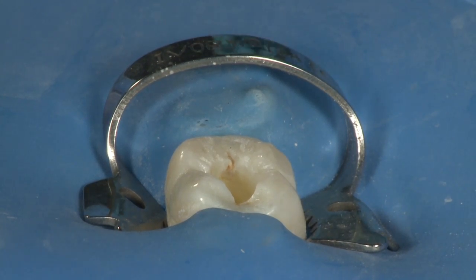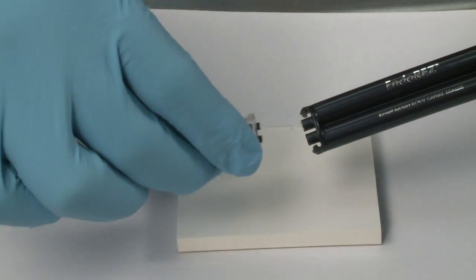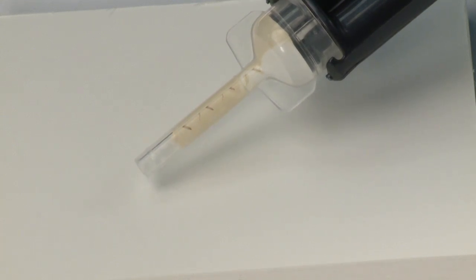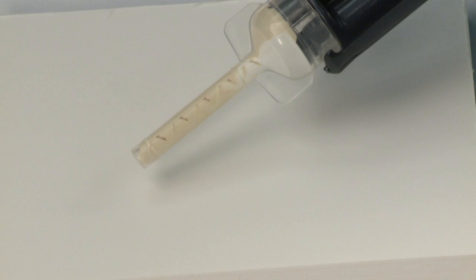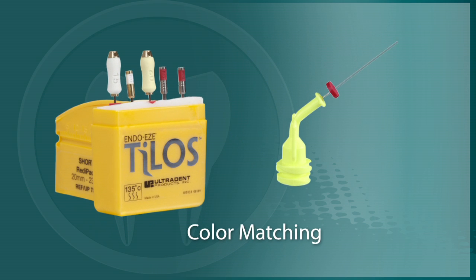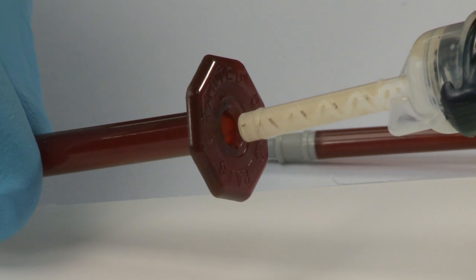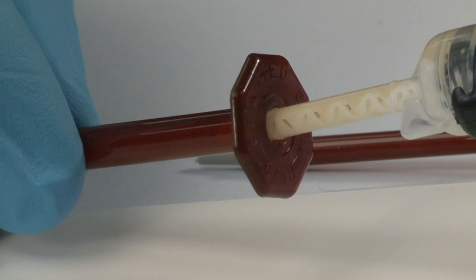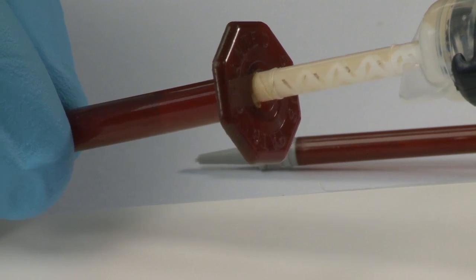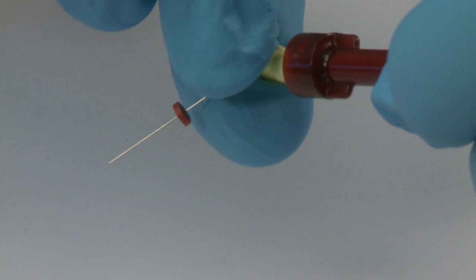Lay the master cone aside while preparing the sealer. Remove the cap from the EndoRes dual barrel syringe and discard it. Attach and lock a clear mixing tip onto the dual barrel syringe. Express a small amount of the resin sealer to confirm that both chemicals are flowing. In order to reach the appropriate length in the canal, the color of Navi tip chosen should match the color of ready pack used when instrumenting the canal. Remove the plunger from a skinny syringe and place the EndoRes mixing tip at the back of the skinny syringe. Gently express a few centimeters of EndoRes into the skinny syringe. It is not necessary to completely fill the syringe. Next, attach a 29-gauge Navi tip to the end of the brown skinny syringe.